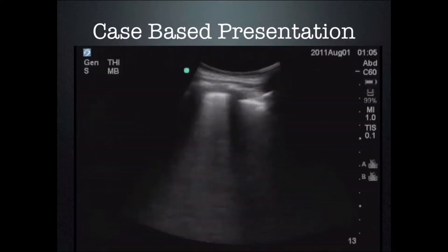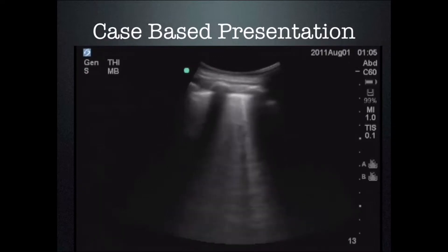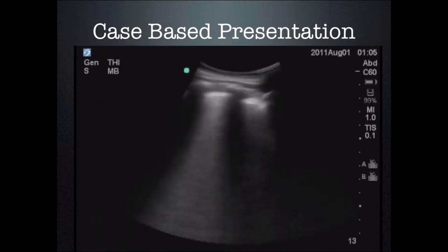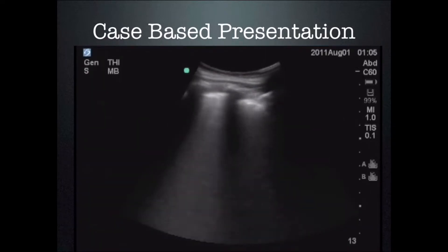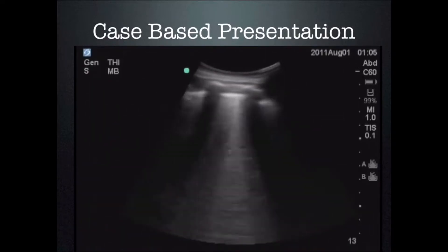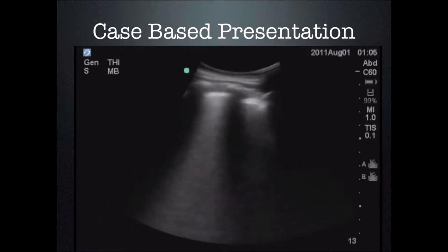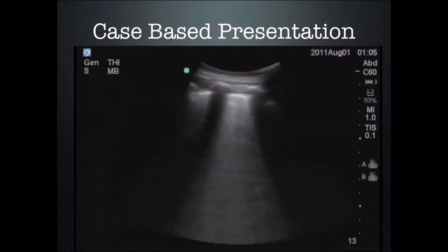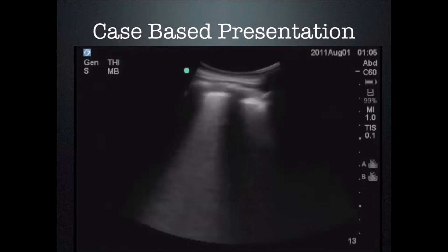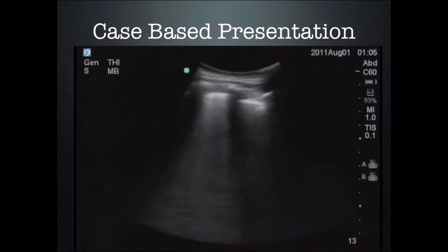Here is our patient's ultrasound. We're using a curvilinear abdominal probe placed on the patient's chest across the ribs. We've identified our ribs and our pleural surface — it is moving — and then we see an artifact arising from the pleura and going off the screen.